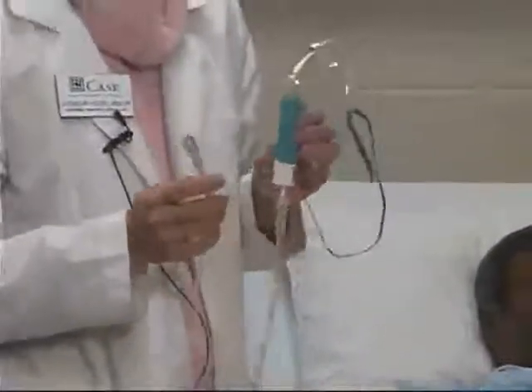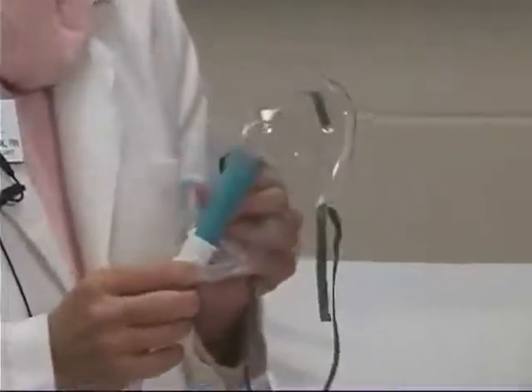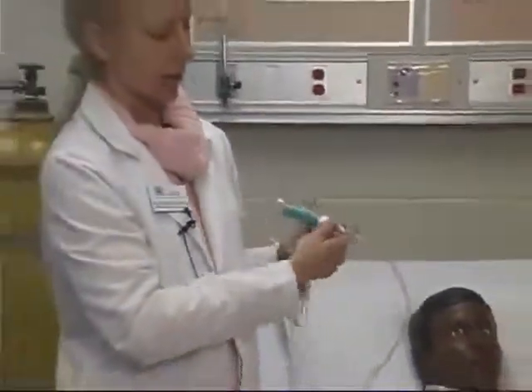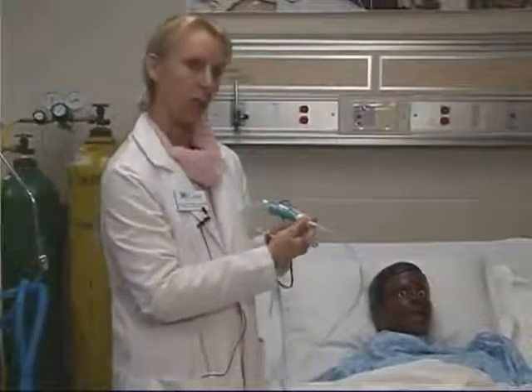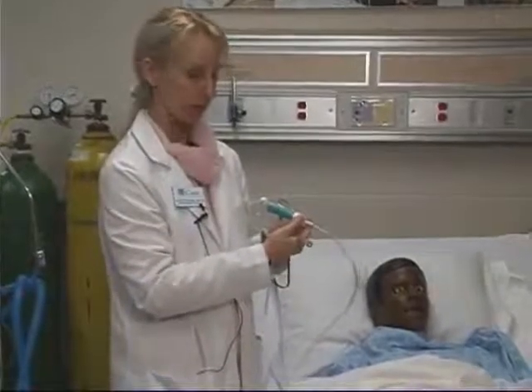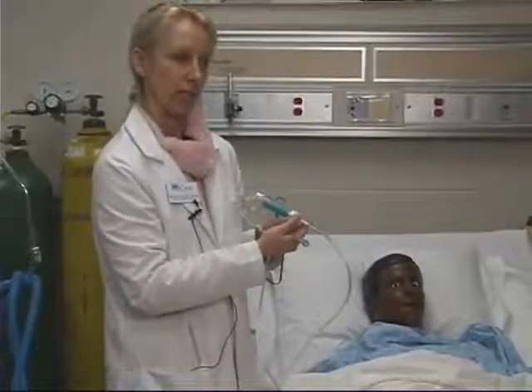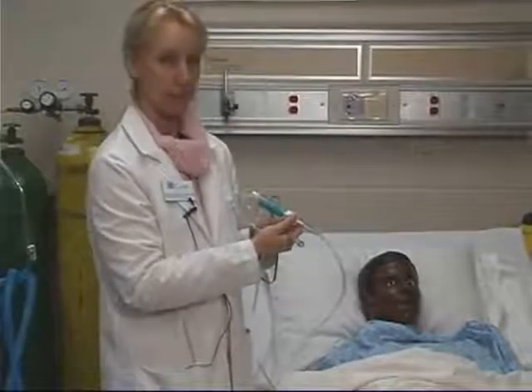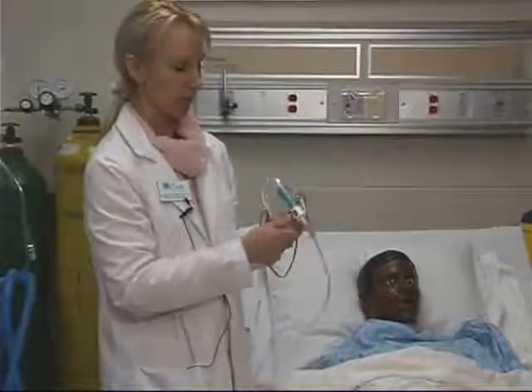The next type of oxygen delivery device I want to show you is what's called a Venturi mask. The purpose of this mask is to deliver a very exact amount of oxygen. If you recall what I said about the other oxygen delivery devices, the amount of oxygen delivered is a range depending on the rate and depths of the patient's breathing and the amount of oxygen delivered from the flow meter.